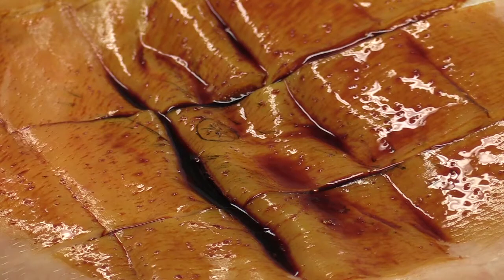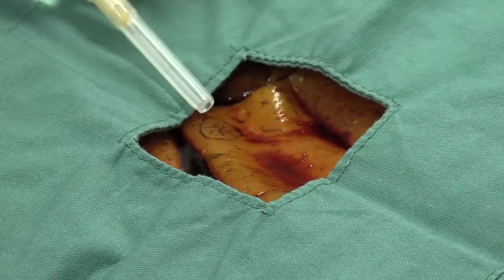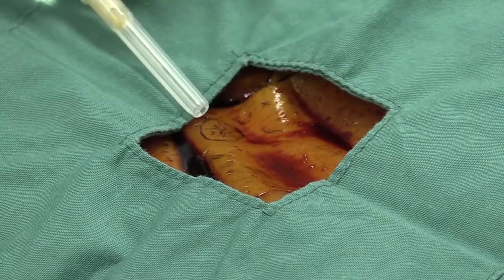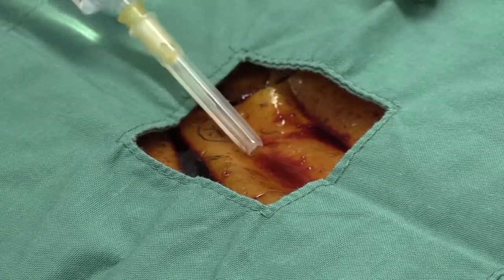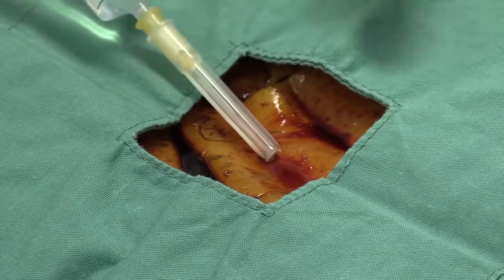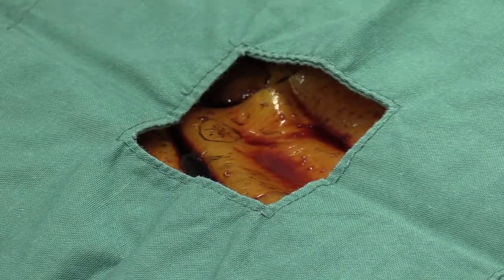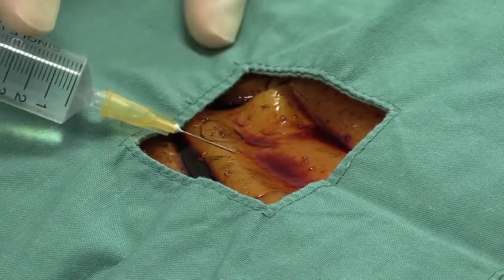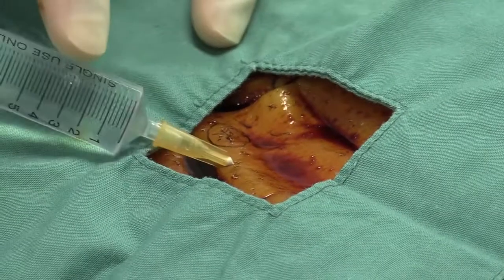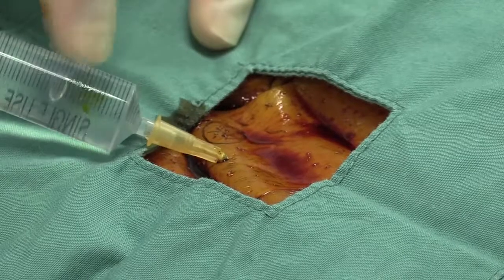Once that's been performed, we then put our fenestrated drape over the area of interest and introduce our local anesthetic. Here we can see the depiction of the umbilicus, the rectus abdominis muscle on either side, and inferior to the umbilicus we are going to insert our local anesthetic. Local anesthetic can either be Marcaine or lignocaine. In this instance it's lignocaine at a dose which is less than 3 milligrams per kilogram.